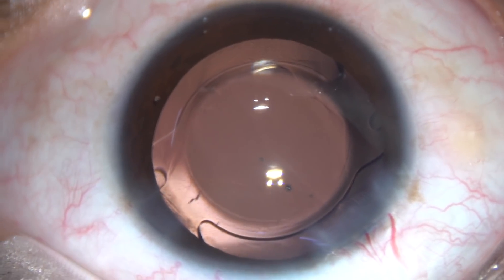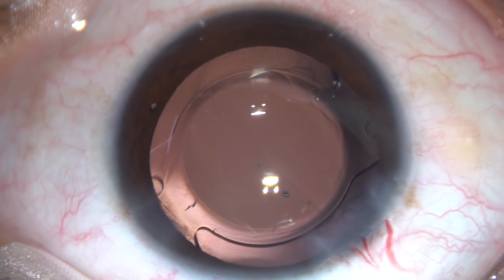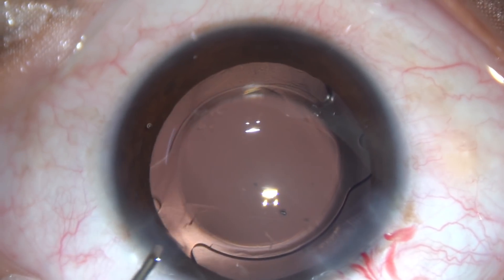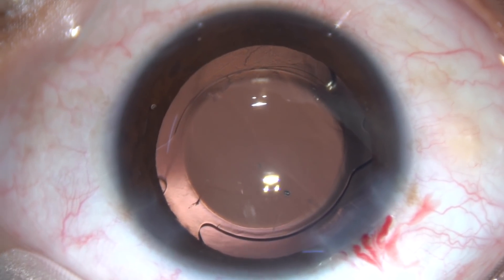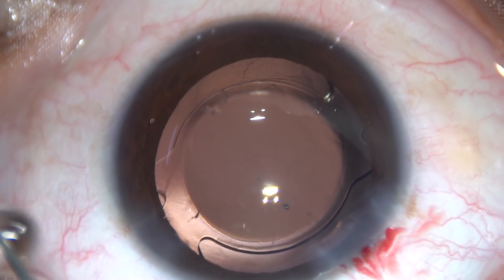You can see there is a crack at the haptic-optic junction. Since this will be covered by the iris, we need not exchange this lens.